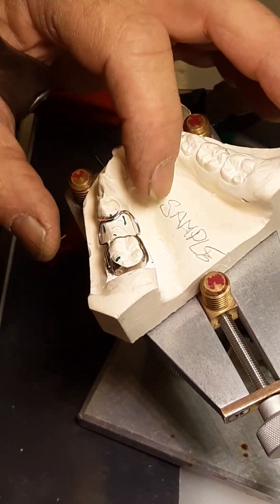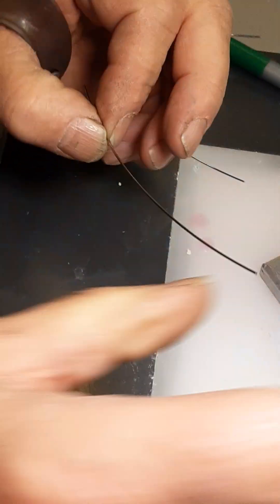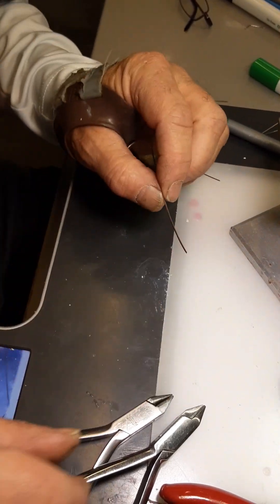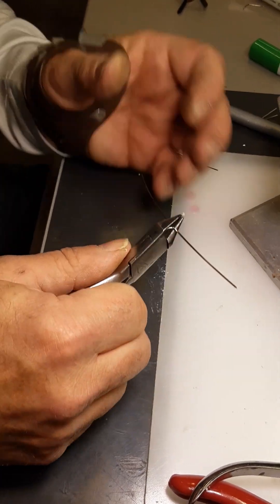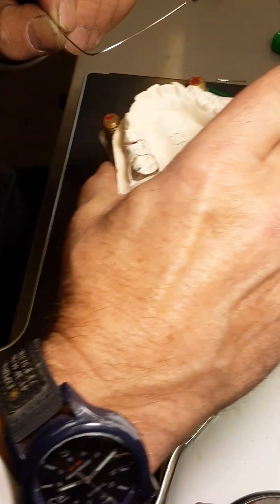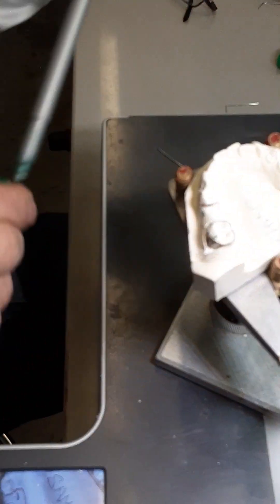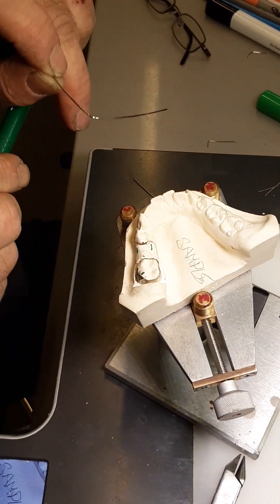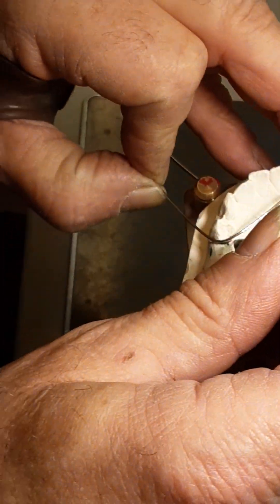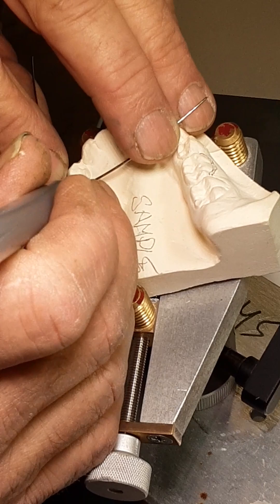I'm going to go through the steps of bending this again. We're going to start off with a piece of wire that's about three inches, maybe four inches long. The first bend is going to be around the center of the wire — a fairly shallow curved bend which is going to go on the distal of the abutment tooth. We want this to go around the distal of the abutment tooth, and I'm going to mark it at just about the width of the crest of the ridge.